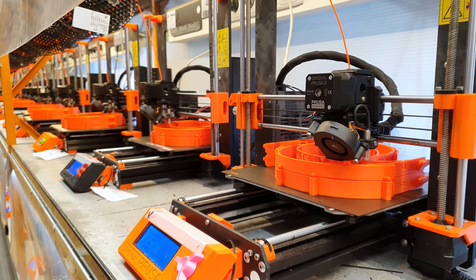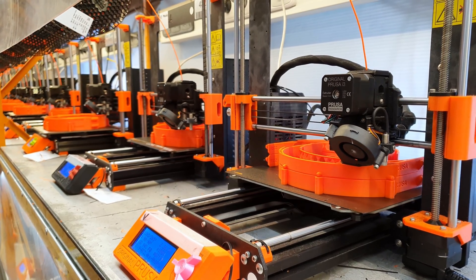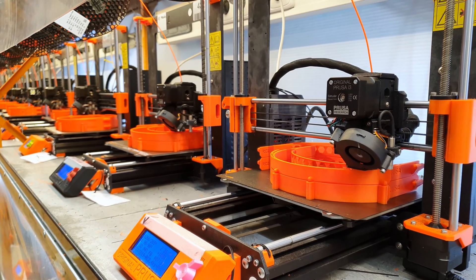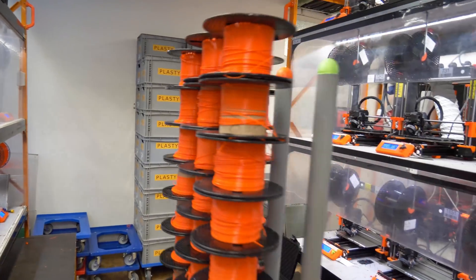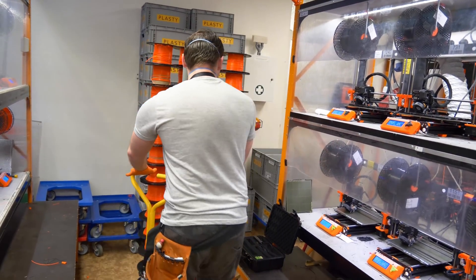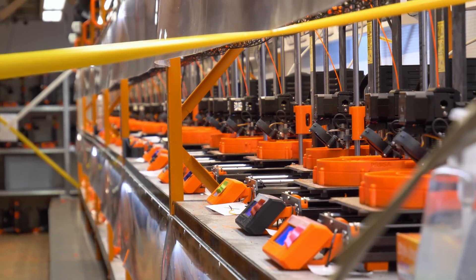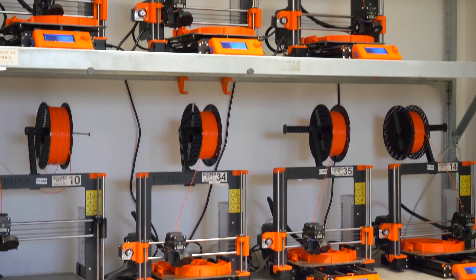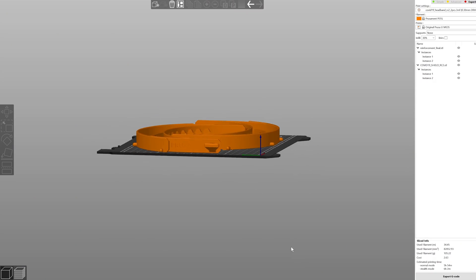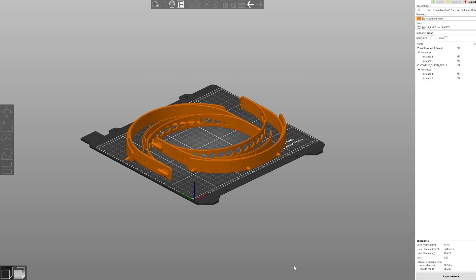Every day I try two to three different print settings or even different models. Our developers are constantly working on improvements — we try to speed up and streamline production, not only the print itself but also the harvesting and restarting of prints. For example, the print waits in a preheated state to prevent itself from getting cold, so it can start printing immediately.